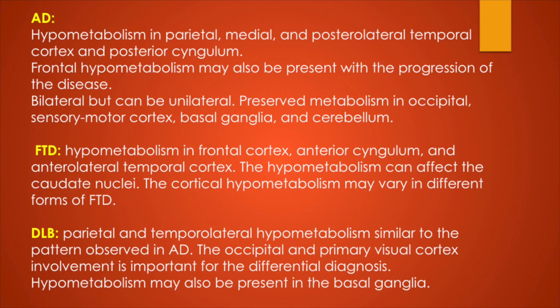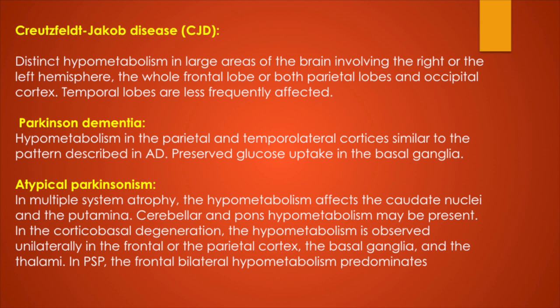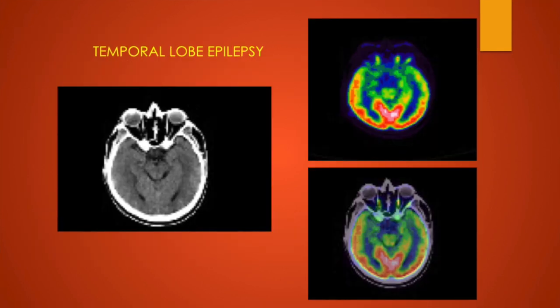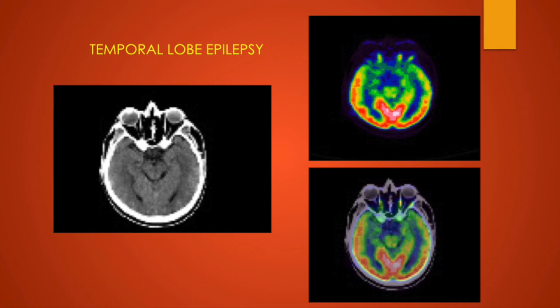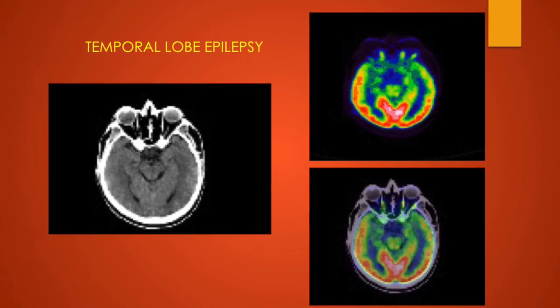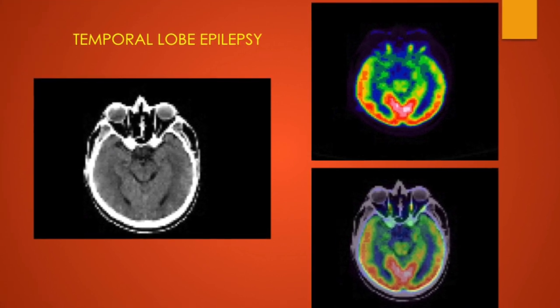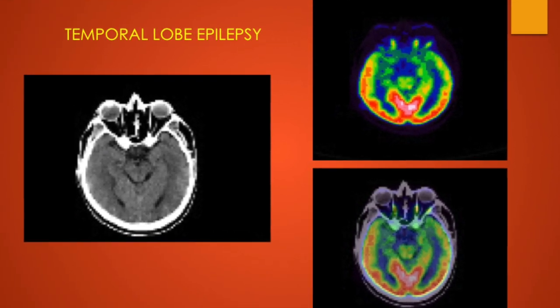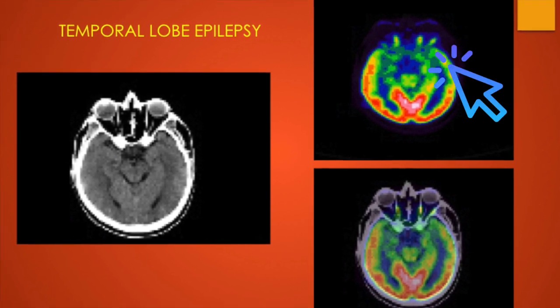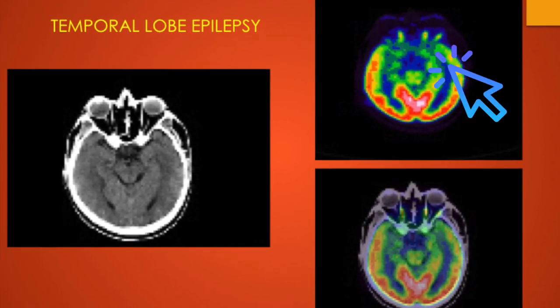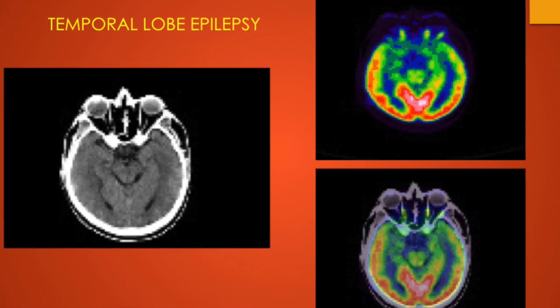Coming to the different conditions of dementia, you have Alzheimer's disease, frontotemporal dementia, and DLB, which I will be showing in different cases. Then you have Creutzfeldt-Jakob disease, Parkinson's dementia and atypical Parkinsonism. Coming to the first case today — temporal lobe epilepsy — you have diffuse hypometabolism seen in the PET and fused PET-CT images. CT is not that much useful; you see a normal temporal lobe, but the temporal uptake on both sides is reduced compared to the other parietal, posterior parietal and occipital lobes. So this is definitely a case of temporal lobe epilepsy.